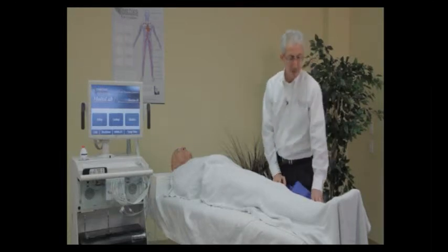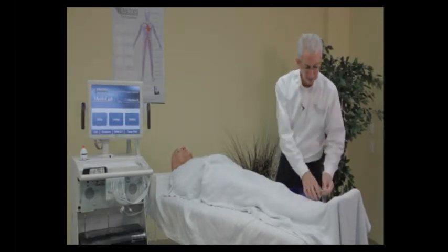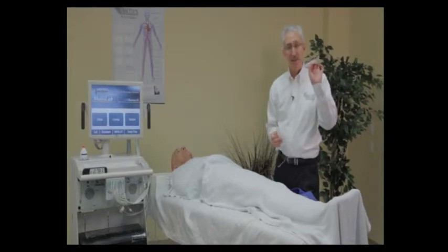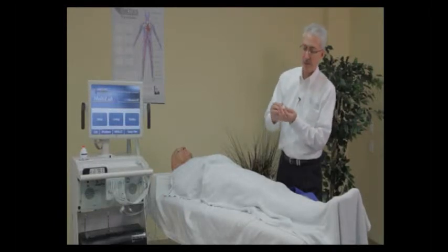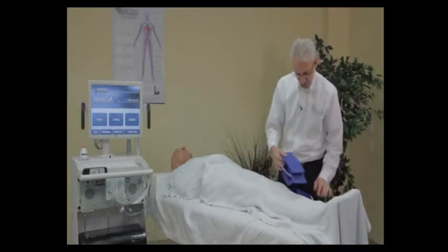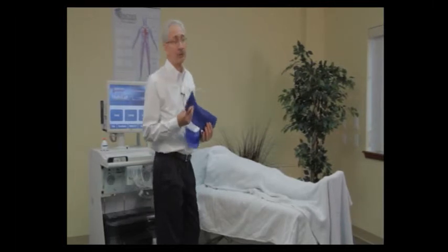Some people like to do a transmetatarsal PVR wave tracing. A 7 centimeter TM cuff is used by placing it around the midfoot. For toes, you can use a PC 1.9 cuff. If the patient has small toes, using the 1.9 will expose more of the toe after wrapping to affix your PPG sensor. The way you put on the cuff is very important to the overall accuracy and speed of your examination.